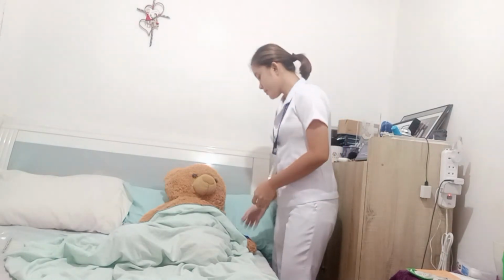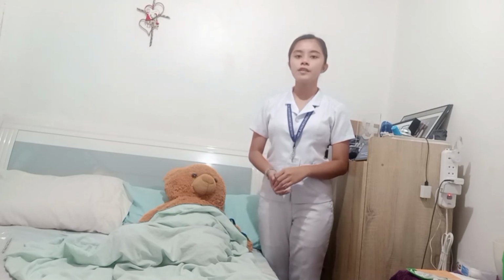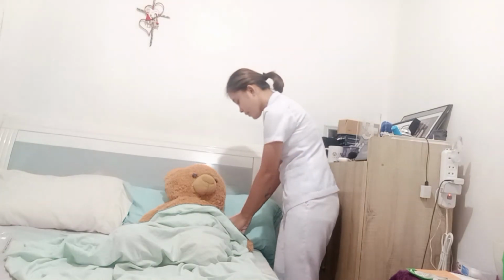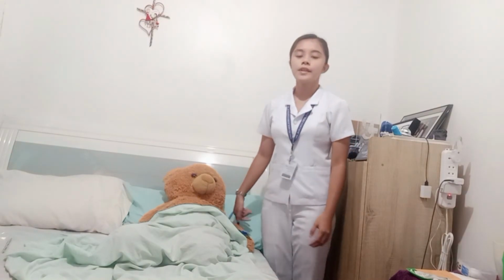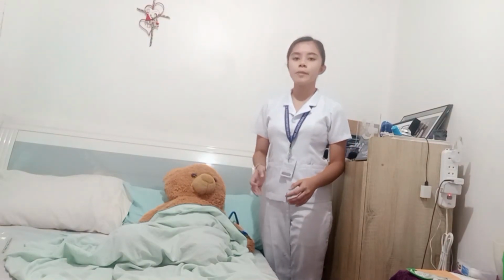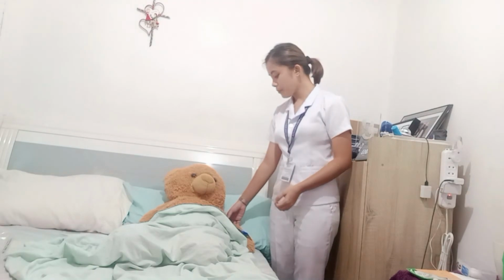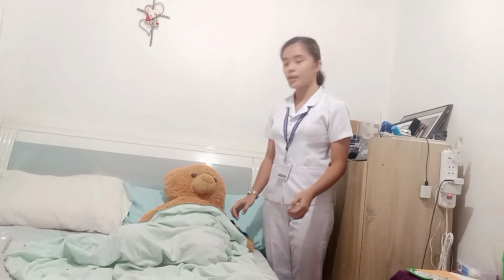Next, examine the integrity and amount of the patient's muscle mass and palpate the muscle for areas of tenderness, which are not suitable for injection sites. Next, inspect the area for bruising, inflammation, and edema. If the skin shows bruises or inflammation, use another site. As I can see here, my patient doesn't have any bruises or inflammation on her deltoid area.